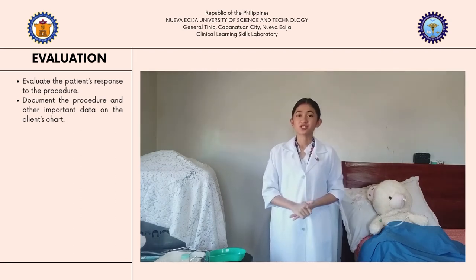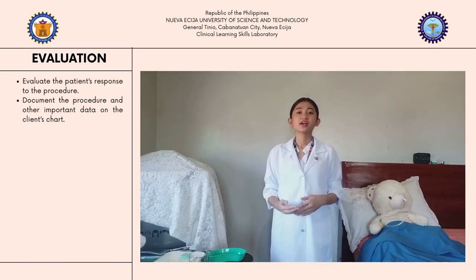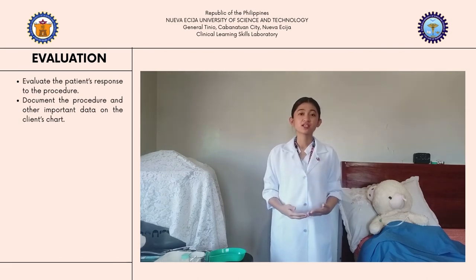Proceed to evaluation and documentation, wherein we will evaluate the client's response to the procedure and document the procedure done, as well as any other important data on the patient's chart.